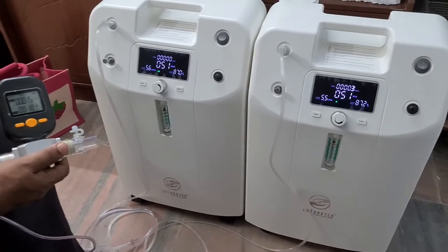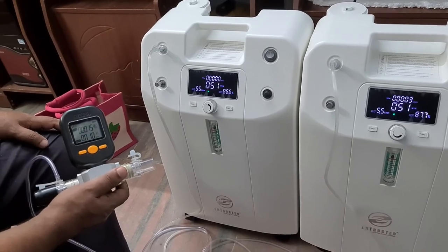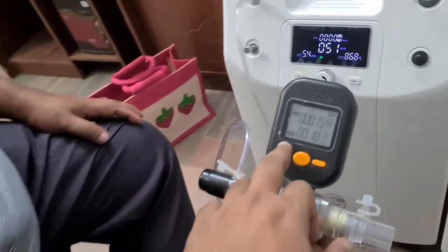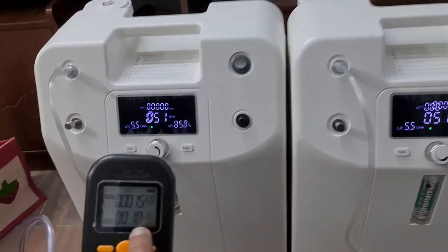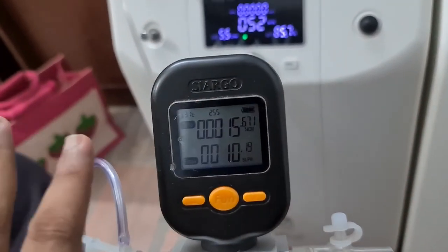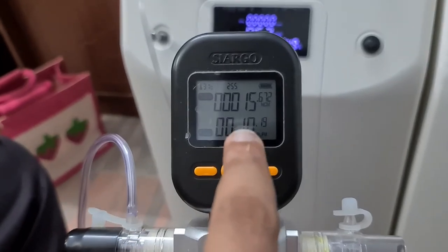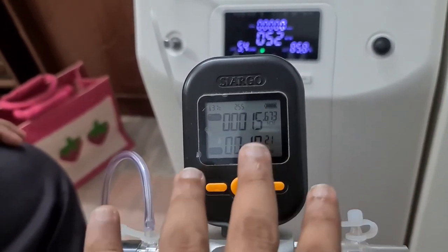To verify with an industrial analyzer — what you are seeing here is a flow meter. In the same setup with two 5-liter machines connected, you can see the output at 10 LPM. There is no loss of flow — whatever flow you want, if you keep both machines at 5, you will still get the output at 10. This is highly beneficial for residential purposes.